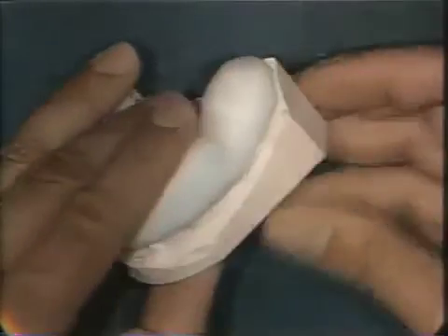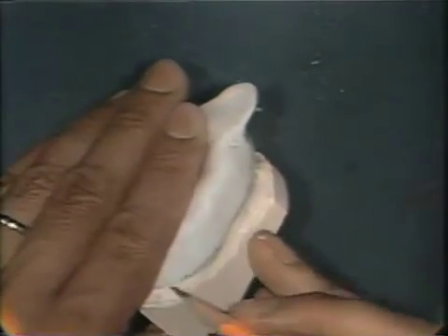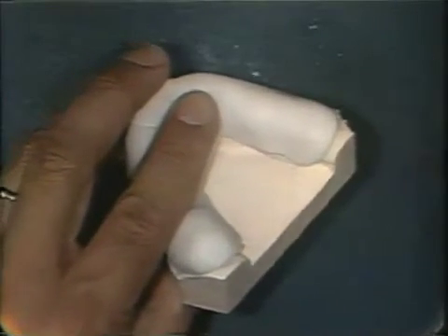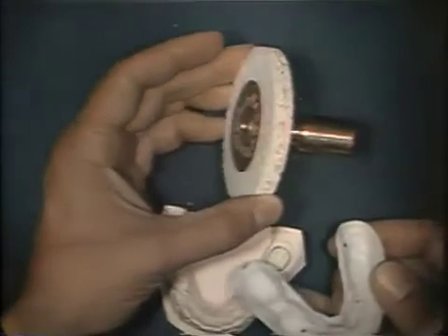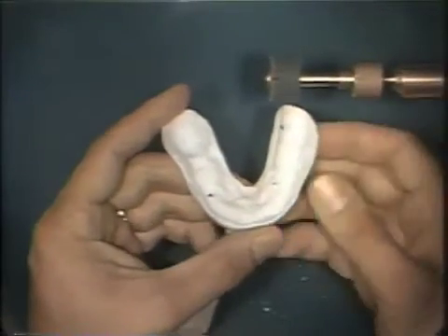The tray is placed back on the study cast and any extensions are noted in pencil. These extensions must be eliminated. The extensions are trimmed with either a fast cut stone on a lathe or with an arbor band mounted on an arbor chuck on the lathe.